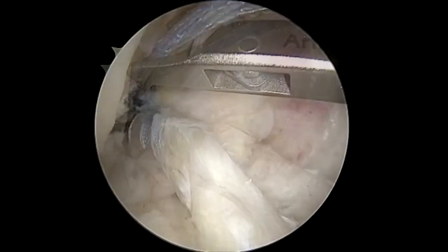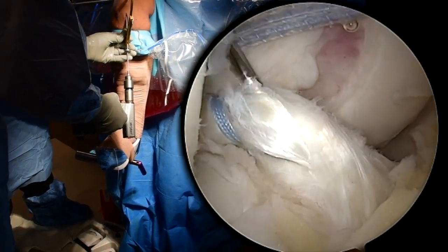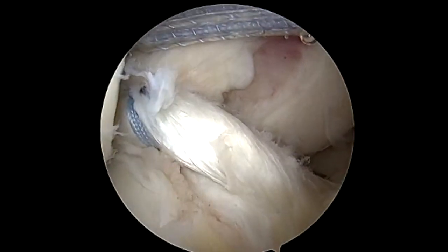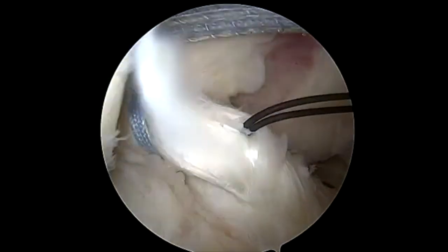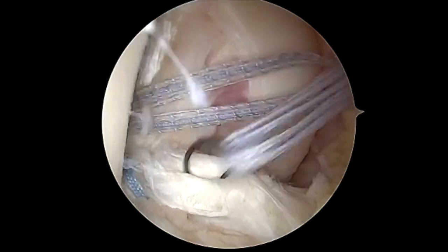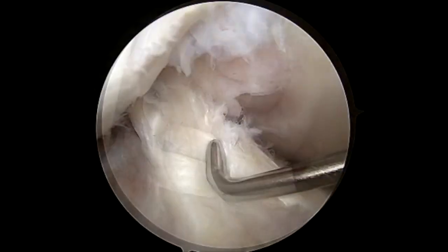After the proximal footprint fixation, an ACL guide is then used to drill a 2.4 mm drill pin up through the tibia from the anteromedial cortex and into the anterior half of the ACL tibial insertion. A suture lasso is placed through this drill hole. Preloaded FiberTape threads are then passed through the suture lasso and shuttled along the ACL substance, down through the tibia. This is fixated with the suture anchor perpendicular to the tibial cortex.